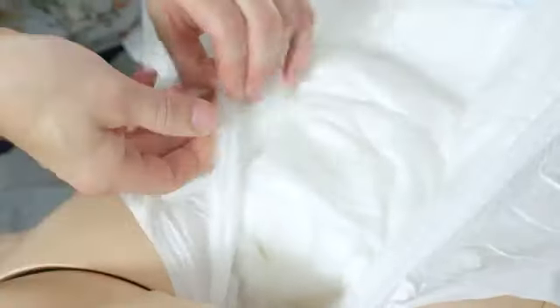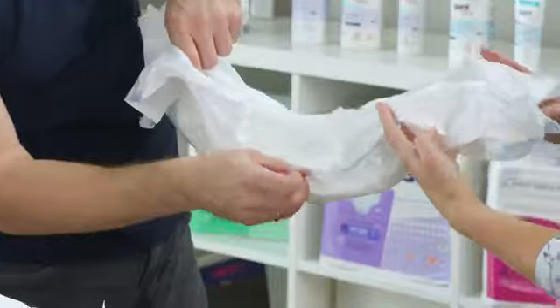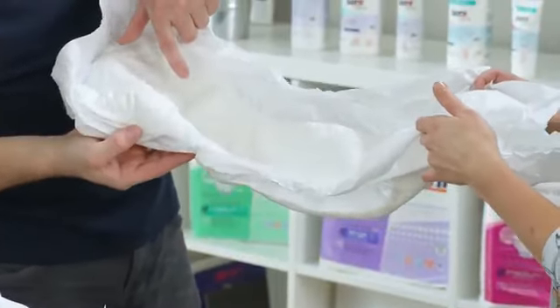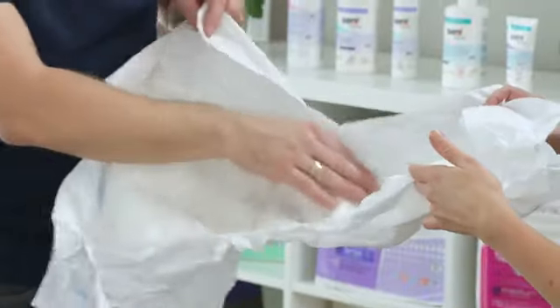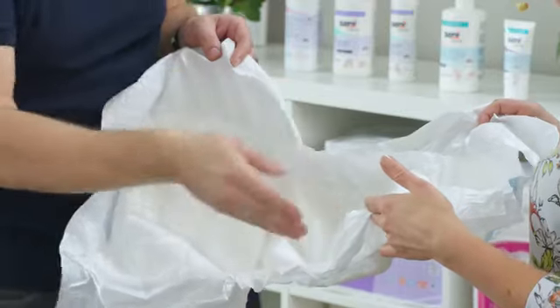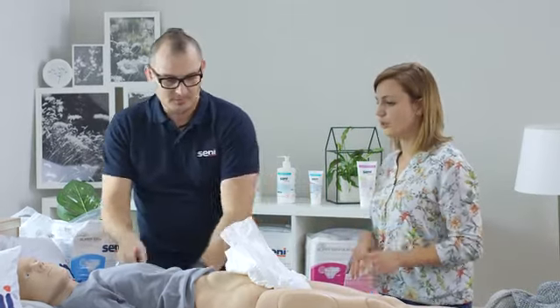When it comes to these side gathers on the open product, it is visible that they are flat. They cannot be seen, but when fitted on the patient, please have a look. They nicely protect against leaks in this part of the crotch, and they are folded out just outside. So imagine the patient's body that adheres here and then enters the crotch very nicely. And these critical points, where side leaks can occur before the liquid is absorbed, they actually effectively protect against leaks. Meaning they perfectly fit the anatomy and prevent any side leakage.